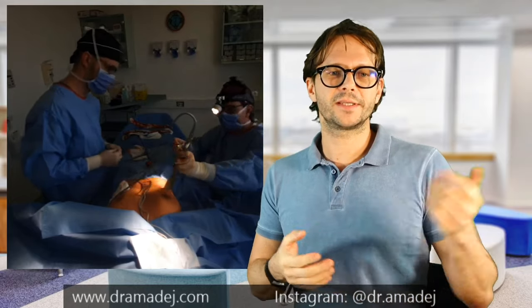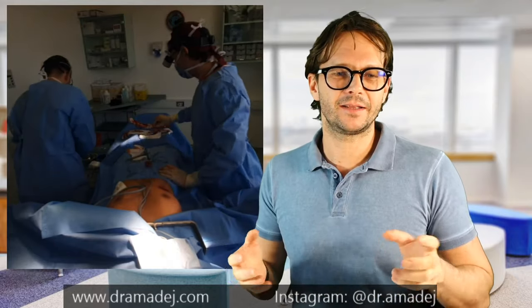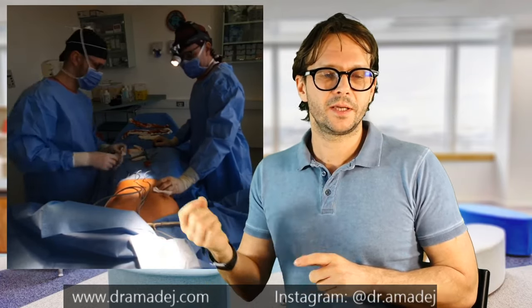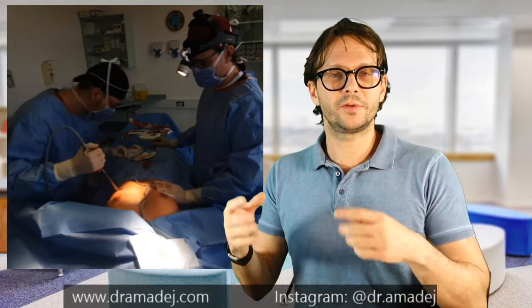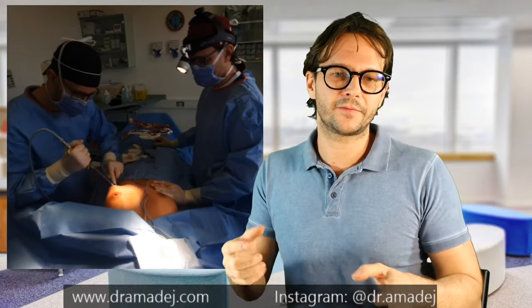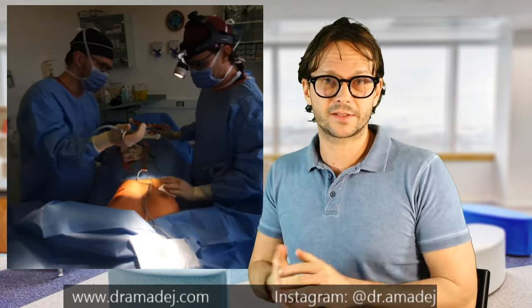As you can see the assistant doesn't have much work during this procedure. It's a very routine procedure so everybody involved — the assistant and myself — knows exactly what the next step is. It's like a dance: we know the moves, we know the rhythm and just go through it. After doing many hundreds of such operations, it gets easier and faster, and the results of course get better and better.